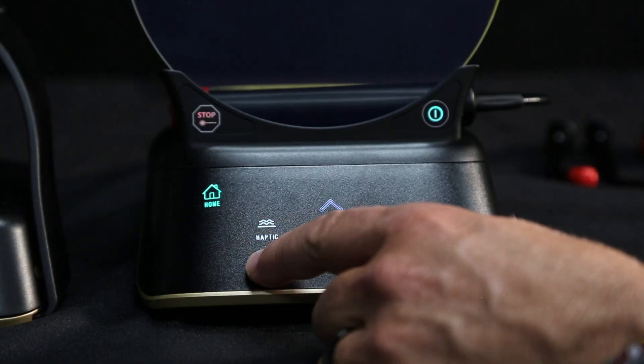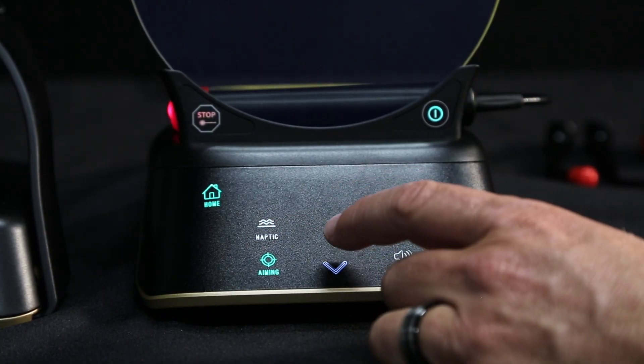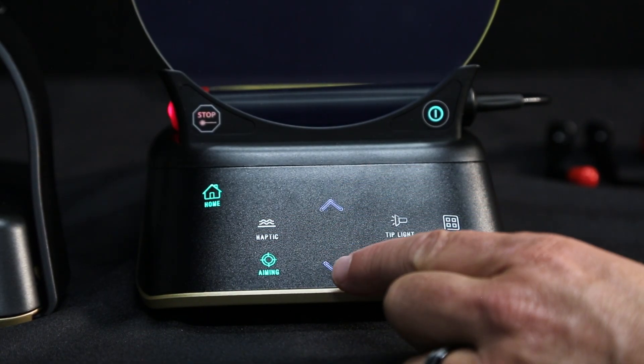An aiming light is also built in to aid you in visibility during treatment. You can adjust its intensity as well as deactivate it.